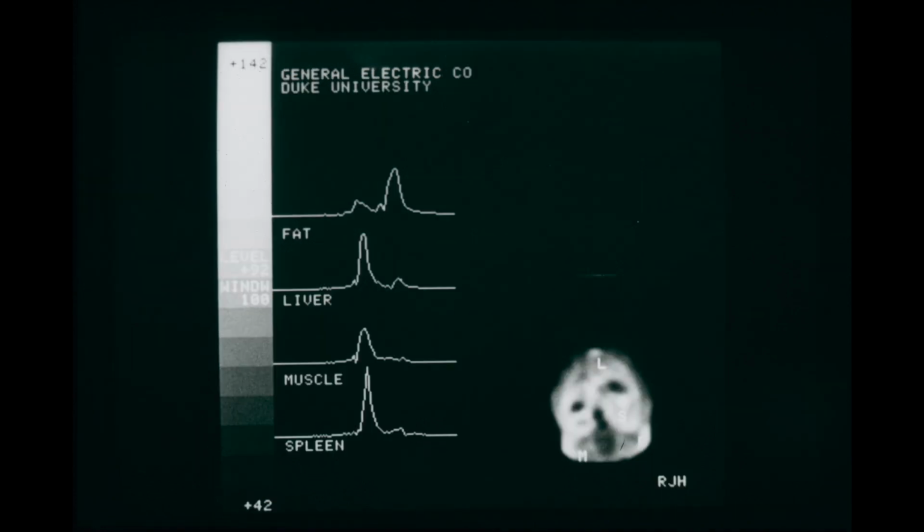and end up with tissues that contain only fat. This data can be displayed another way, which is we can display the full composite image, and then from each area we can pull out the appropriate NMR spectrum. In this case, liver, for example, is predominantly water, which is what we saw in the chemical shift image. And then if we go out to the fatty area, we see predominantly fat with a little bit of water. The only negative thing about this technique is it does take a fair amount of time. This data set took roughly 20 minutes to acquire.